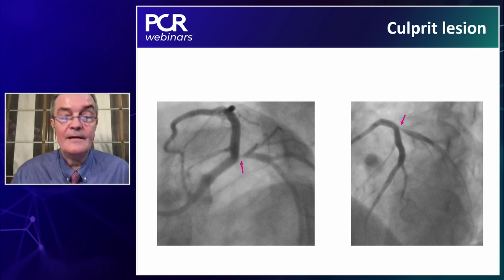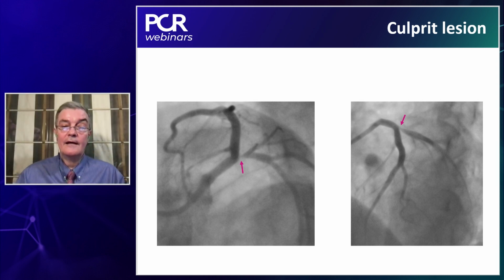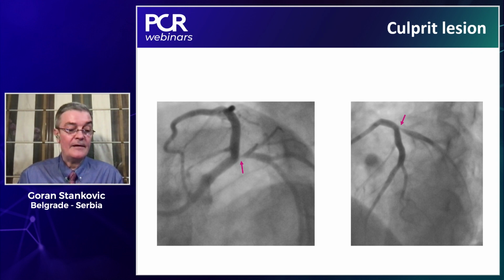Yeah, definitely. And I think this clarifies the importance of image guidance when we have isolated lesions of any of the ostia, LAD or circ, because guiding the index procedure with imaging will help you really clarify the extent of plaque, composition of plaque, and vessel diameters.